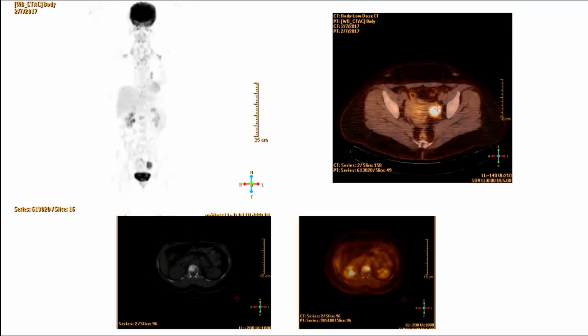So this looks like metastasis from breast cancer. We challenged the pathology to revise their reporting. They revised their reporting, and they said, okay, it could be a breast cancer. We did mammography and MRI of the breast; a small breast tumor, which was a lobular cancer, was found. The ovary mass was operated, and it was metastasis from lobular cancer. Just because of pattern recognition knowledge of how these tumors behave, we managed to switch the case from primary ovarian, which should be treated with carboplatin and paclitaxel, to metastatic breast cancer, which was treated completely differently.